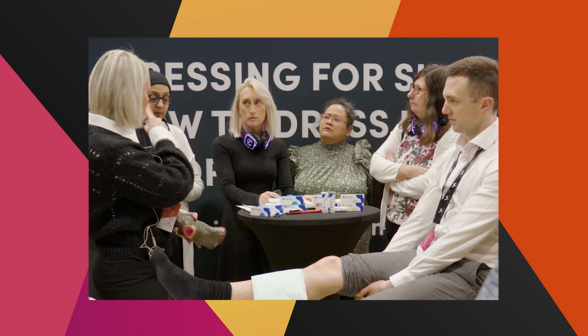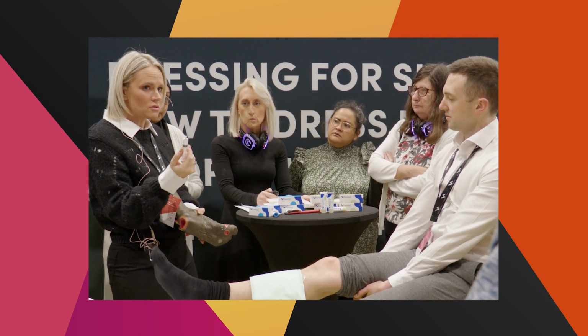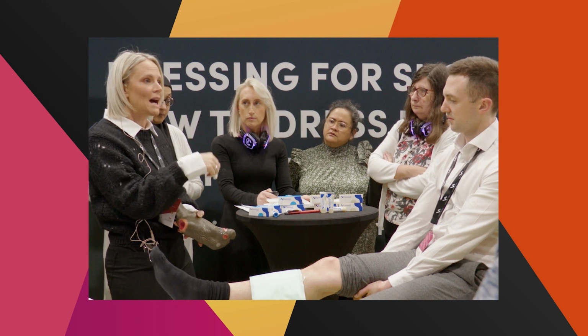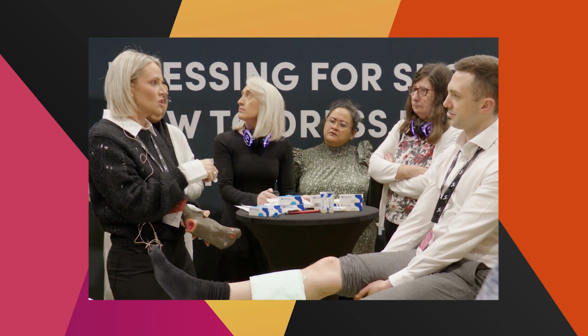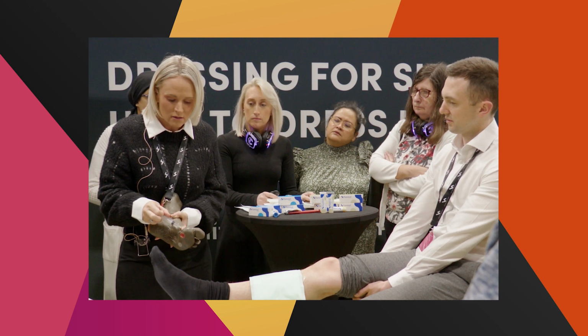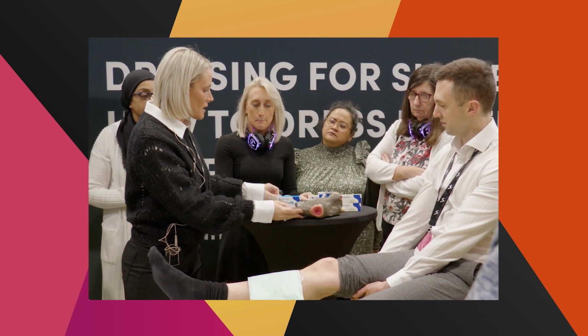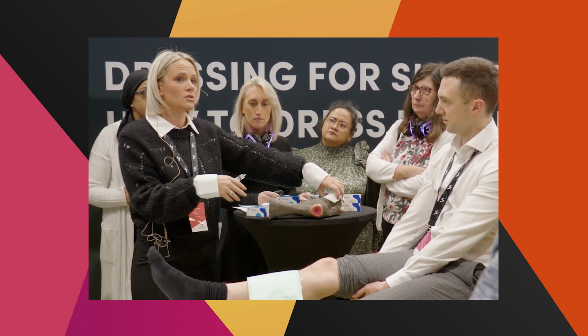Lou will show you the difference. She spoke to you about the Hydro and Forte, but you can use the nozzles, okay? And that's really good if you want to pack, say, a pilonidal sinus, where you've got a track in, you've got undermining, and you can then just apply Flaminol.